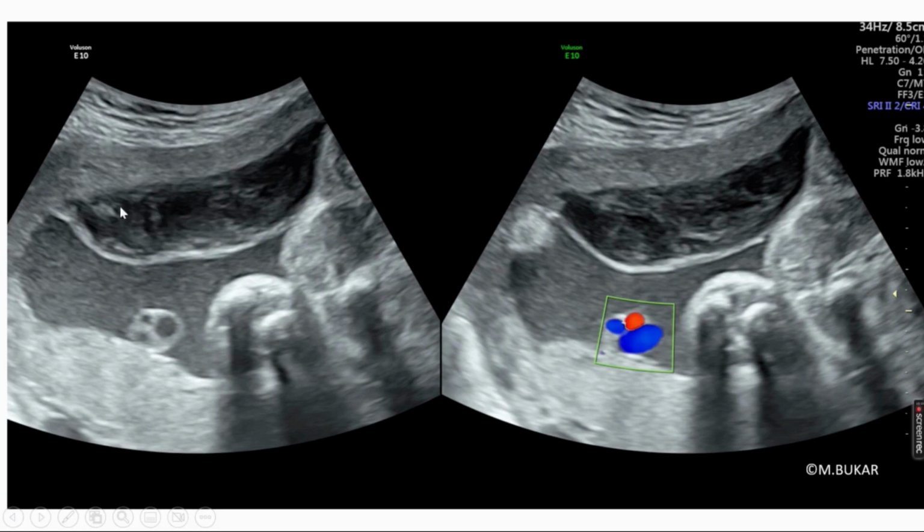This was at 30 weeks of gestation. The myometrium, the chorionic plate, and the subchorionic hemorrhage. So this is a small subchorionic hemorrhage.